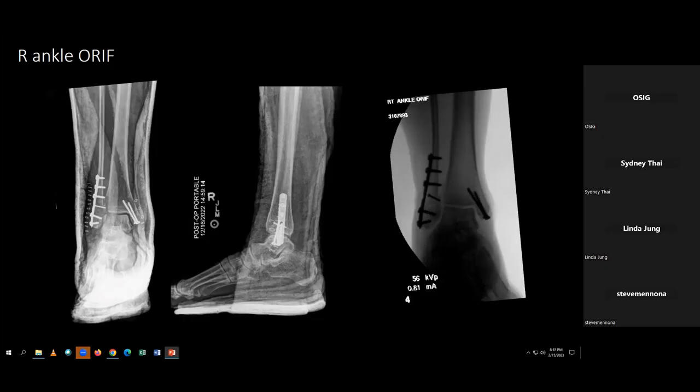Exactly. So this is different than the hip fracture that dies 2 days later. This is the one that if you don't do a good job, it's going to come back and plague you throughout your career, because you're going to watch progressive arthritis and further increased disability as they go along. So how did you fix this? What did you use there?